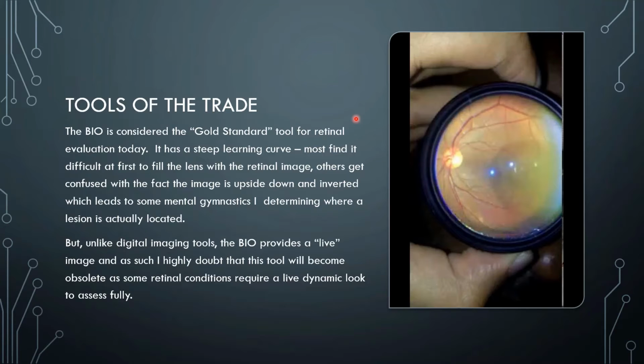And with the headset, you also use a lens. You hold it in front of the patient's eye, and now you can see how much area that a BIO covers. So quite a bit more than the direct ophthalmoscope. So it's considered the gold standard tool for retinal evaluation today. It has a steep learning curve.